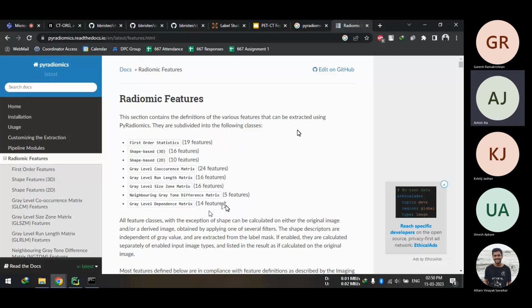Yeah, so we have also developed that lung tumor segmentation module. There we can segment lung tumor, but not other sites, because the difficulty increases when you enter the neck region or the pelvic region. So currently we have developed one module which segments lung tumor. But here we are trying to segment every tumor. That will be great. Okay, perfect. Understood.